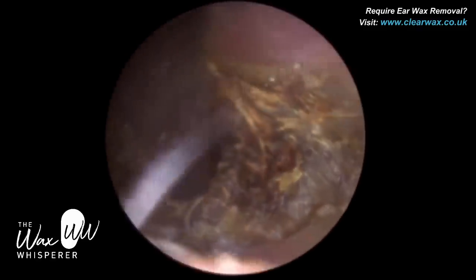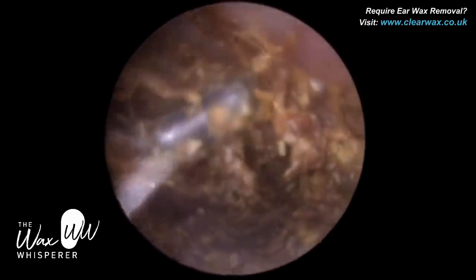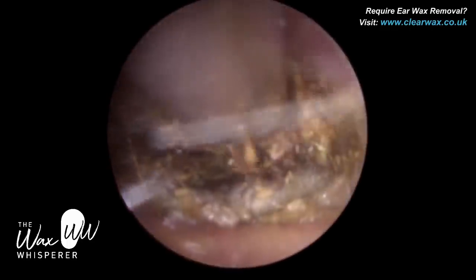I'll explain that in a moment. I've just come back in with the earhook again and I've just managed to chisel in. Sometimes with an earhook the aim is to kind of slice and dice this hard piece of wax into pieces, then re-enter with a suction probe.